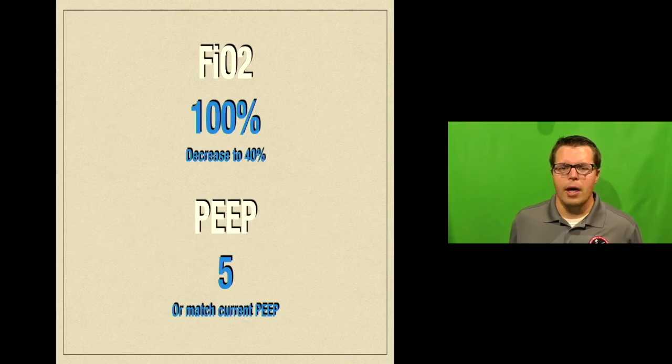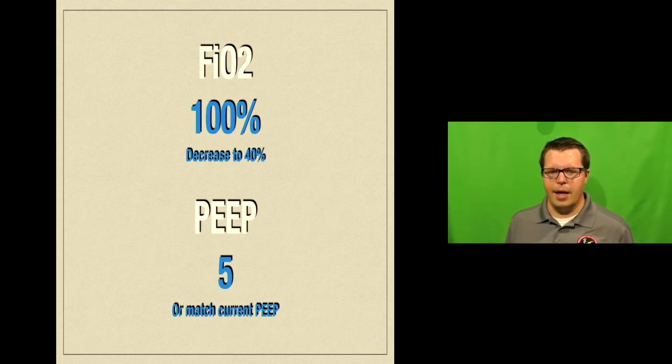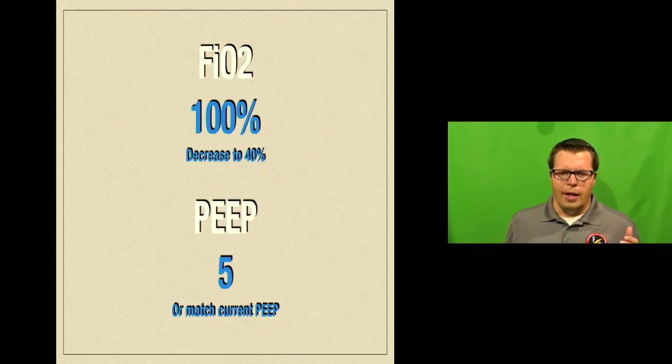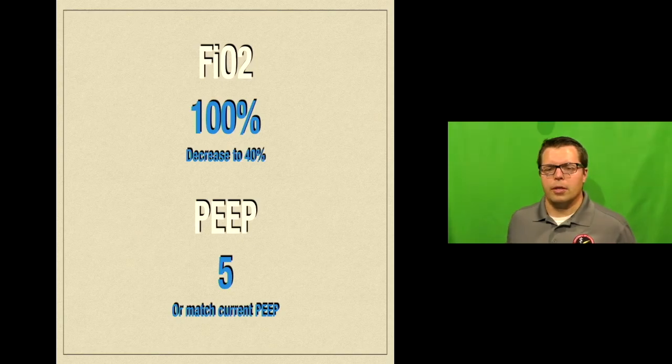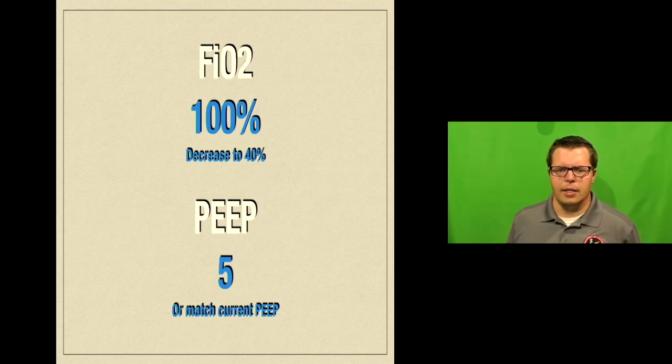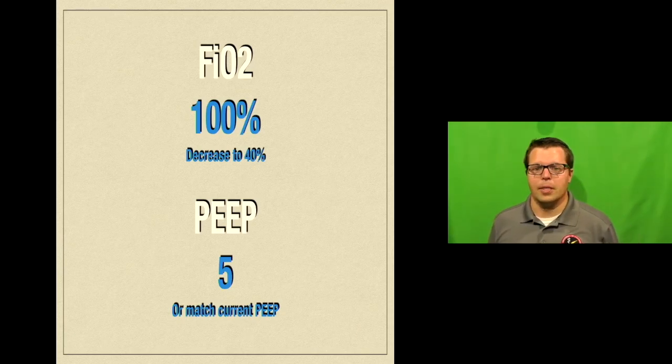We're going to set our FiO2 initially as we're making the transition to 100% to make sure the patient's getting as much oxygen in case something happens, but then we're going to rapidly titrate that down as soon as we're stable on the vent to 60% or 40%, something low, trying to maintain a SpO2 of somewhere between 94 and 99%. You don't want it at 100, you don't want it at 85, but something in the middle there. If they have bad obstructive lung disease, we'll even let that kind of drift down to the upper 80s. If they have terrible COPD and they get ventilated and their SAT is 88%, that's actually not too awful bad. And it may take a lot of work to get it any better than that and potentially be dangerous.